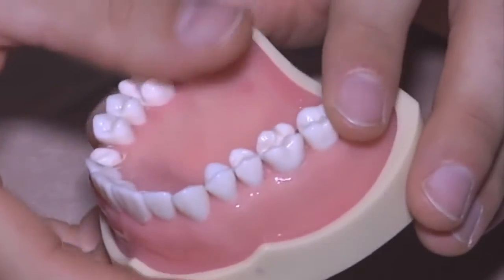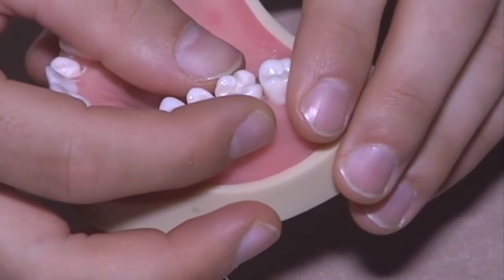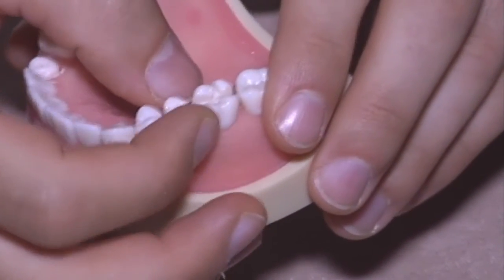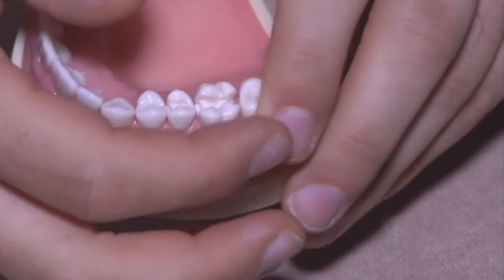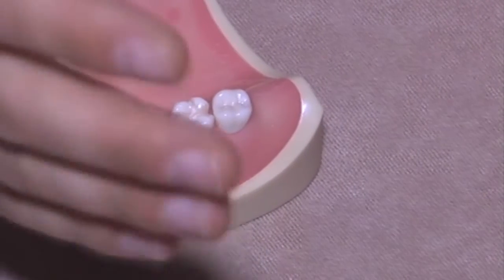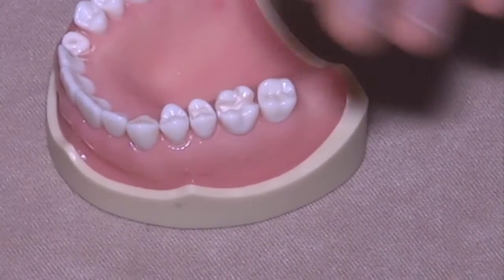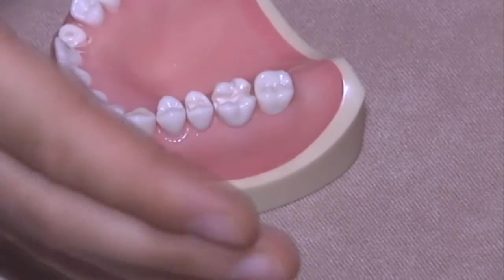Usually in these very common cases, I used to perform a centripetal build-up technique. The centripetal build-up technique means that once you prepare the cavity, the first step is to transform the second class to a first class, building up the interproximal wall.